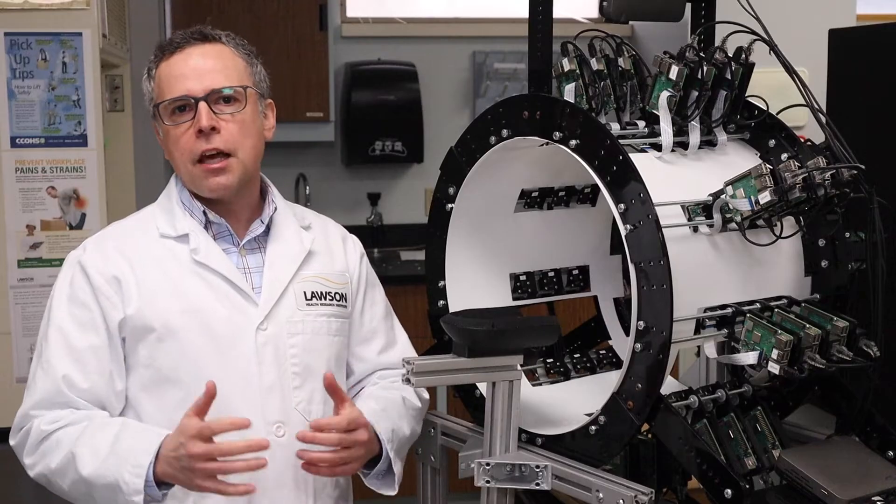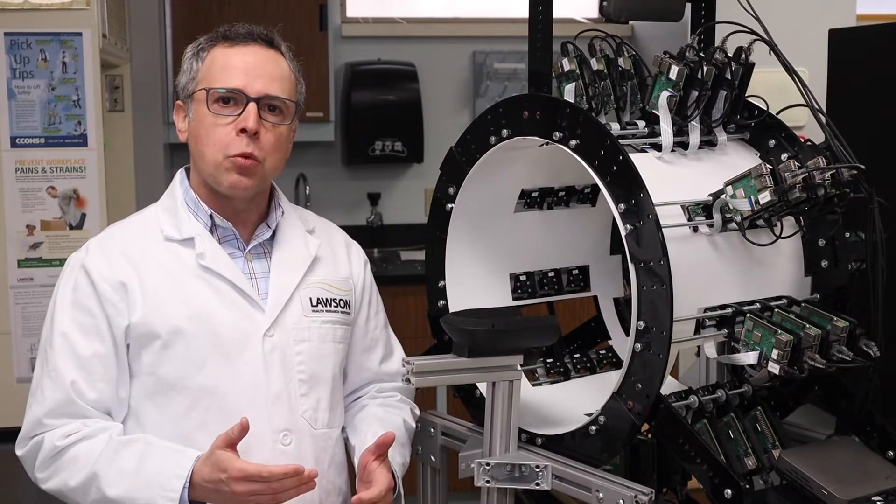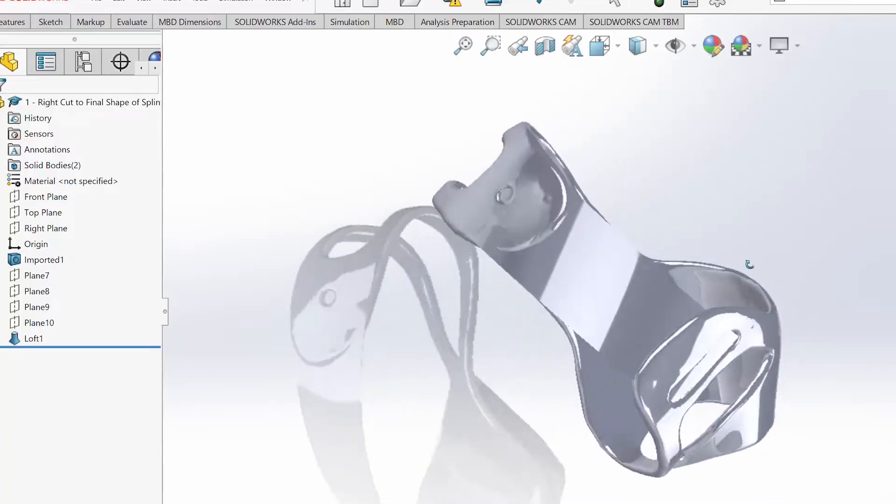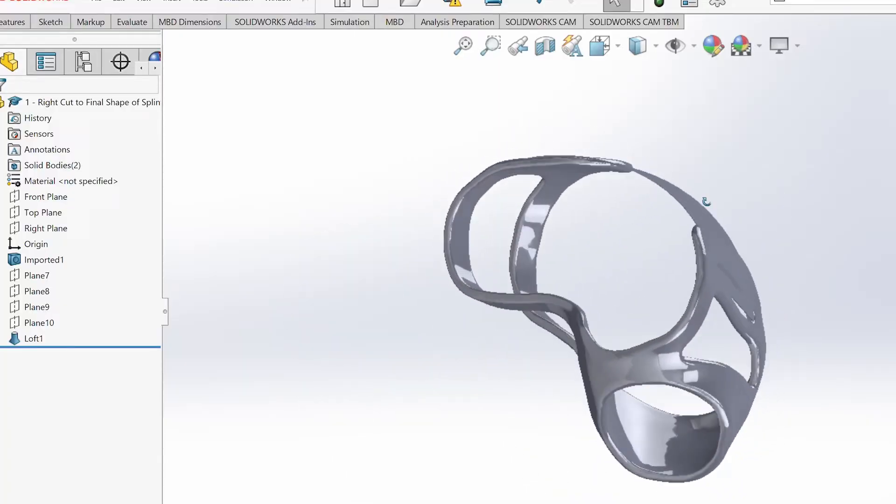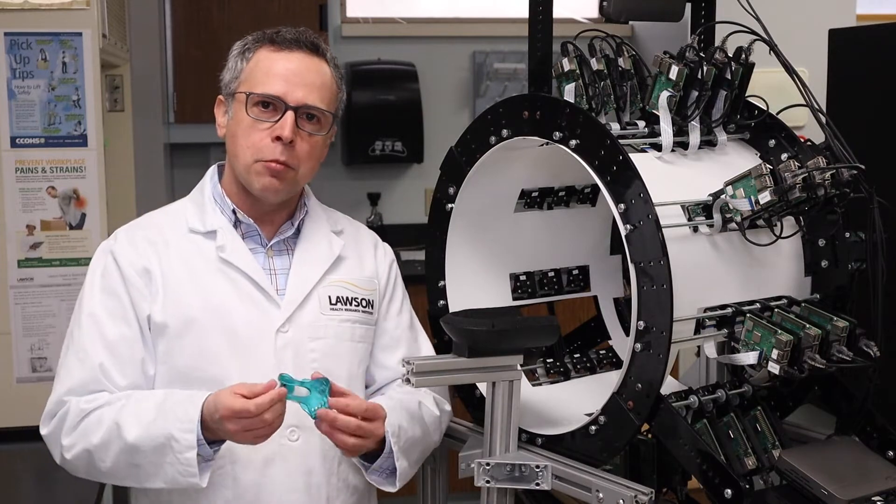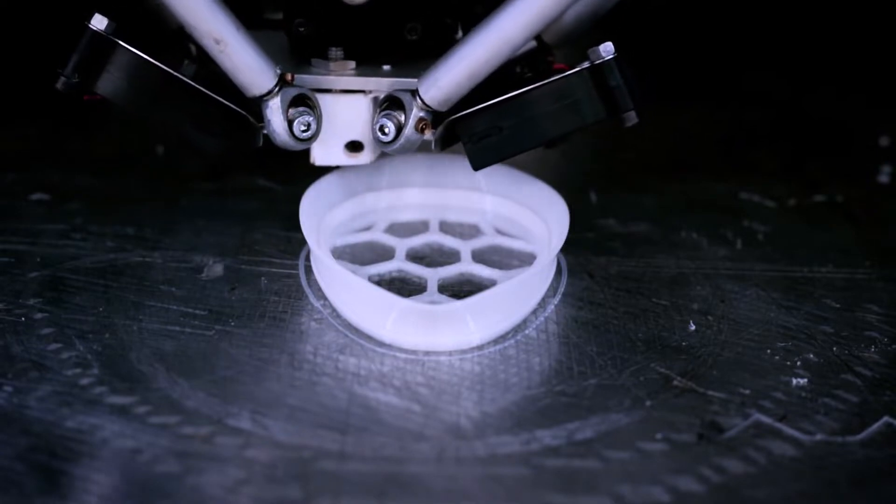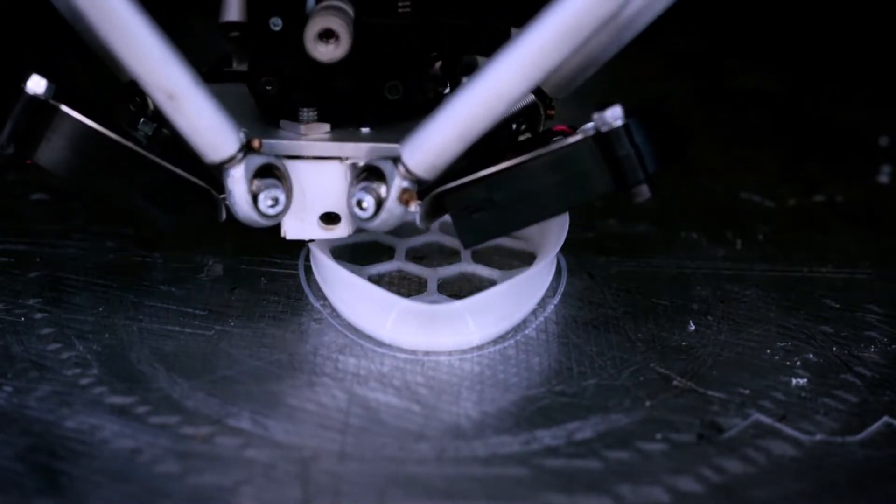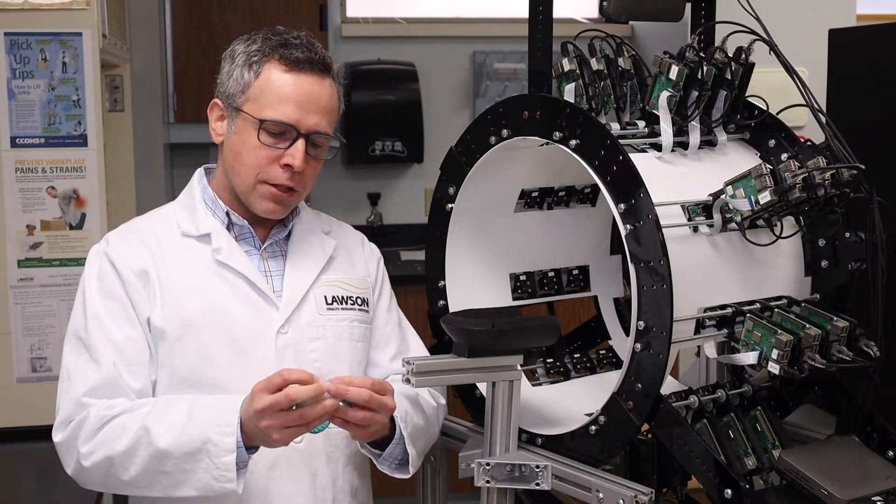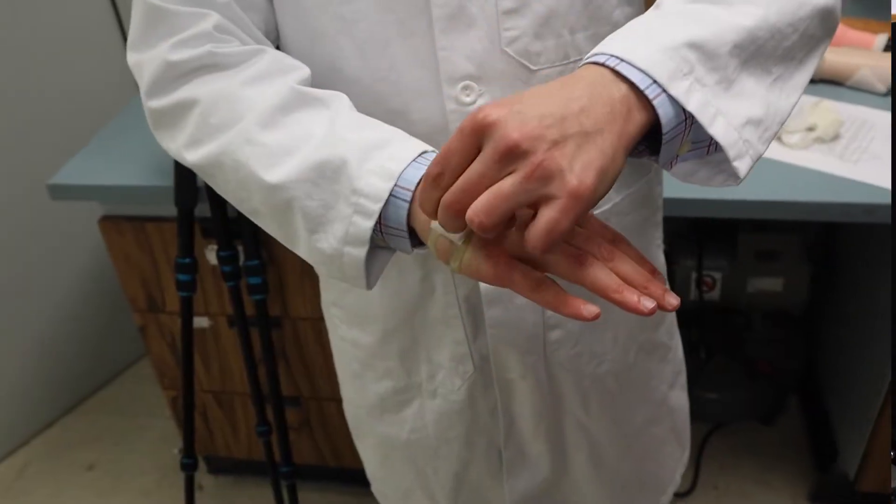We take that 3D model into our software, and from that we can create a splint which would look something like this as an example. From here, we would send that model to a 3D printer which would produce this, and then the therapist would place a fastener on it so that the patient can wear it comfortably.